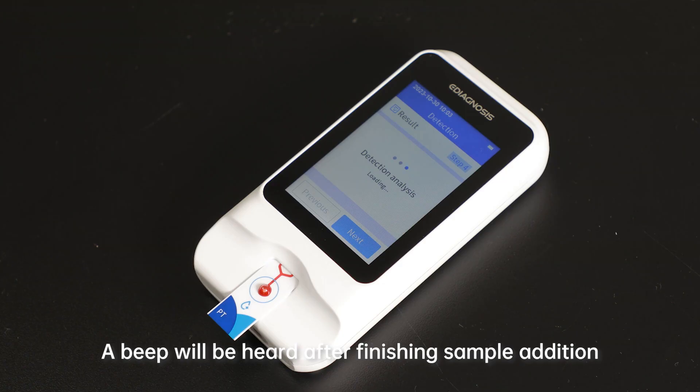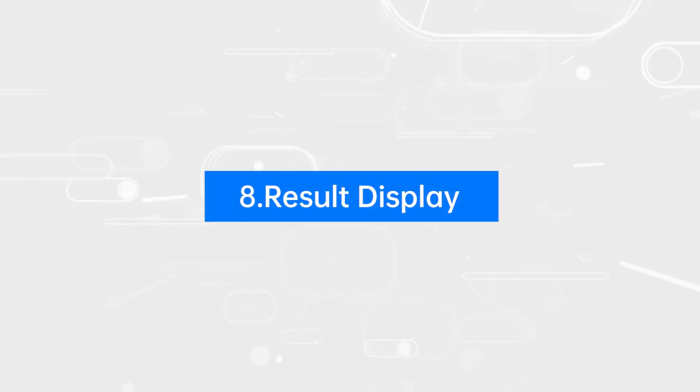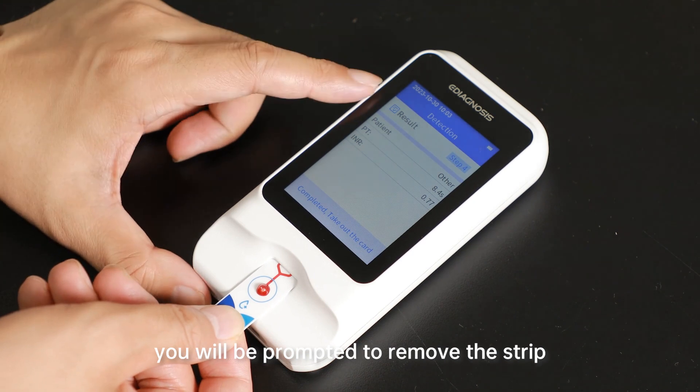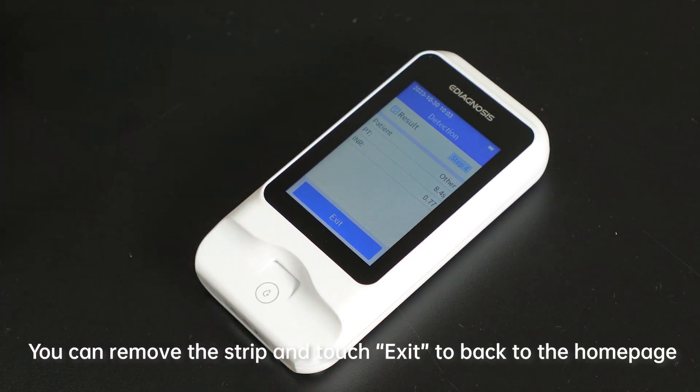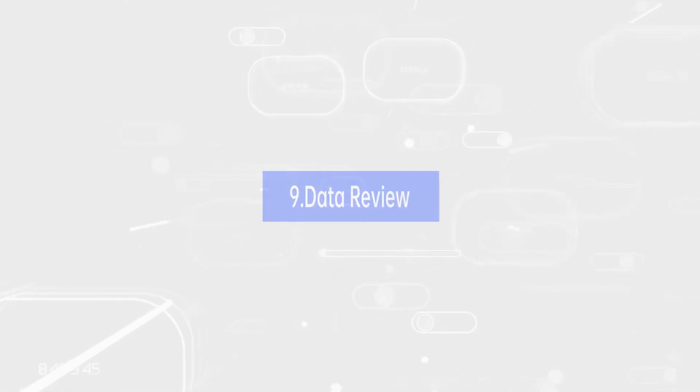Step 7: Wait for test result. A beep will be heard after finishing sample addition, then wait for the test result. Step 8: Result display. After the test result is displayed, you will be prompted to remove the strip. Remove the strip and touch Exit to return to the homepage. Used test strips should be discarded as medical waste. Do not reuse.